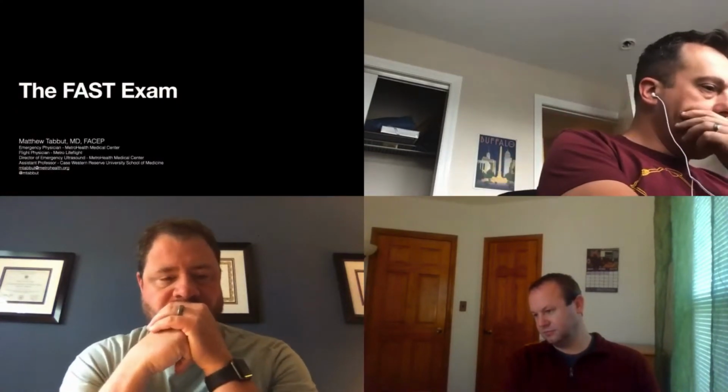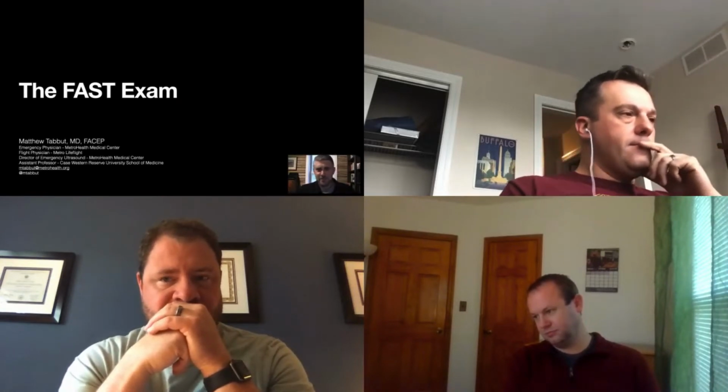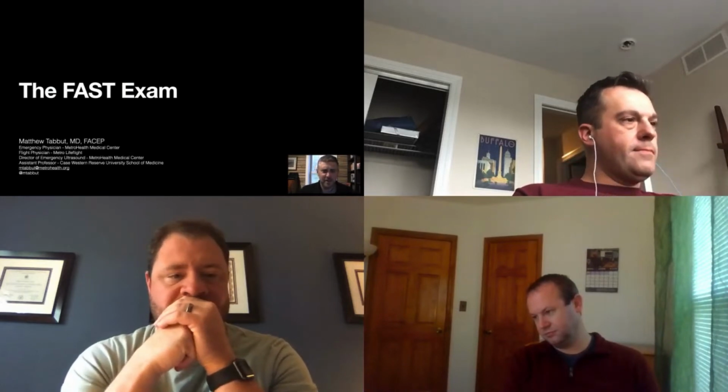And I couldn't come up with a better title. I apologize. It is what it is. So if you guys come up with a better title, great. But anyway, the FAST exam, some unique cases.